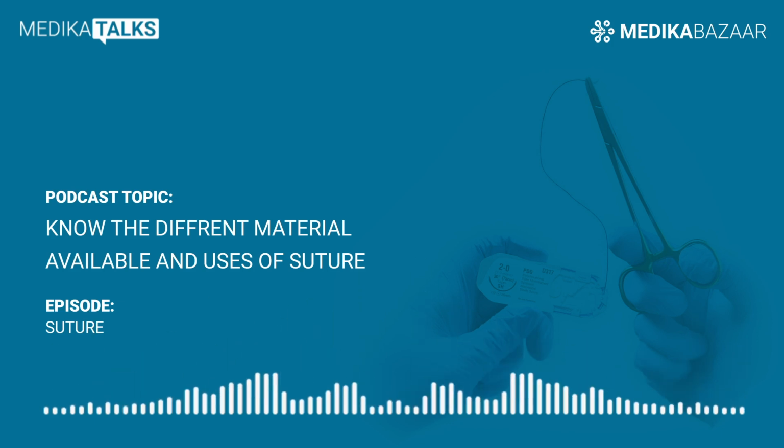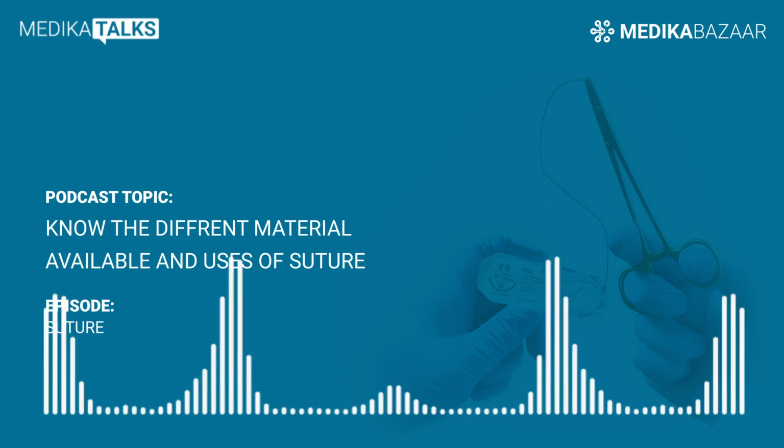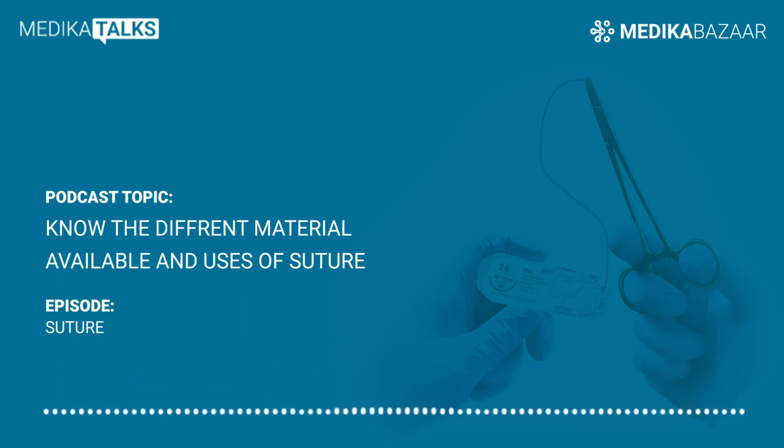While it is more secure, a braided suture also increases the potential for infections. Finally, sutures are also categorized as being made of synthetic or natural material, but it does not make much difference since all suture materials are sterilized.